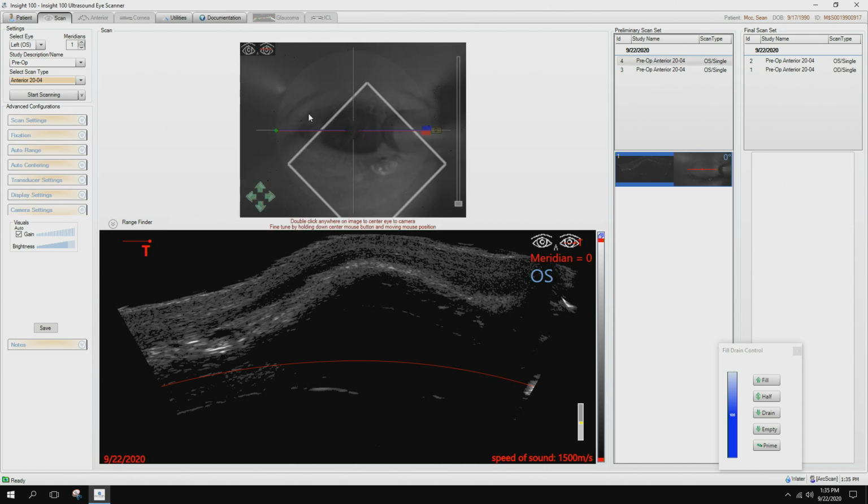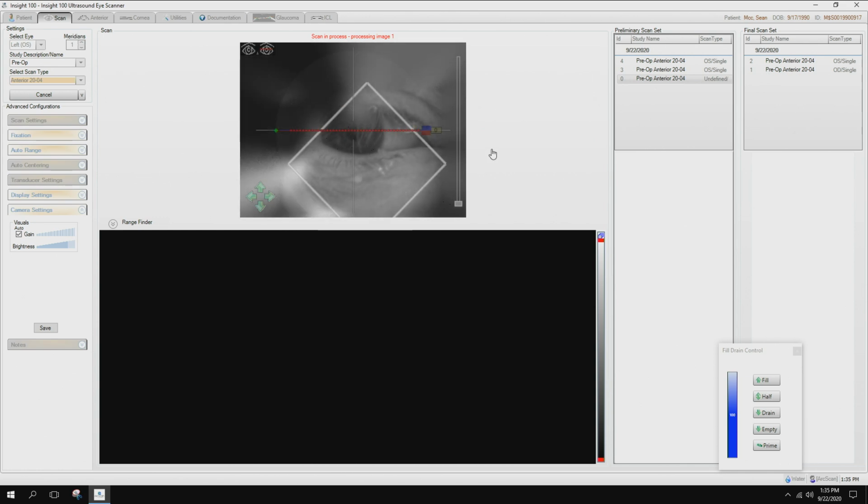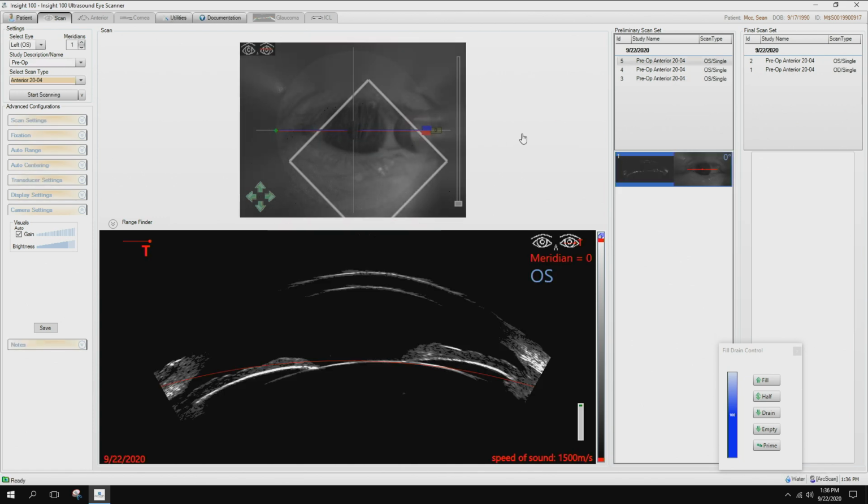and initiate your scan. I can still see bubbles on this patient's eyelashes. I can see their upper lid lashes are pushing down through. However, we're still fairly centered. We ought to be able to get a good image on this. It's a simple bicanthal plane. Let the instrument center, wide open, and there we have a good image right away. So just taking a few moments while the eye seal is dry and centering the patient on the eye seal will help you get a good image quick right away.